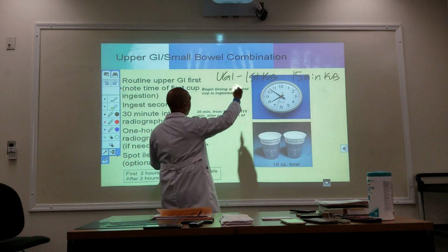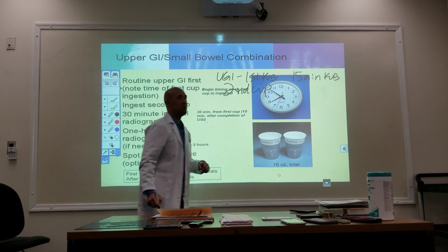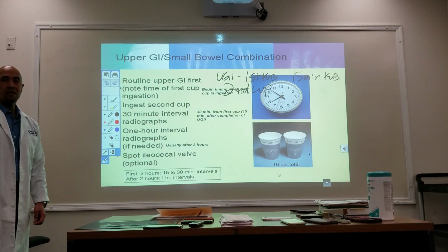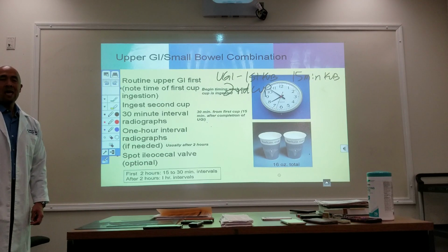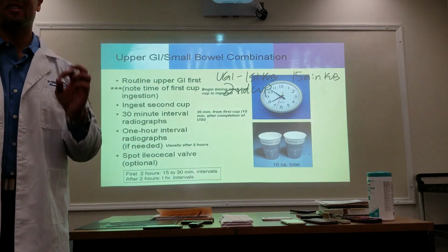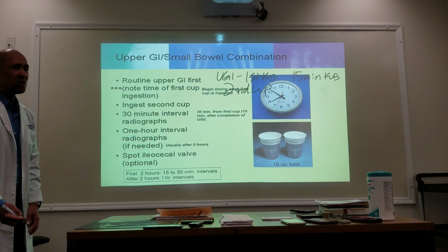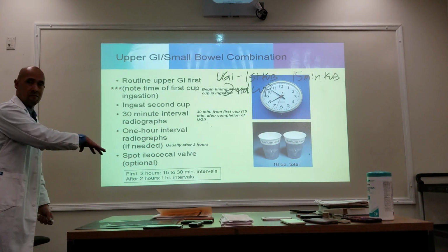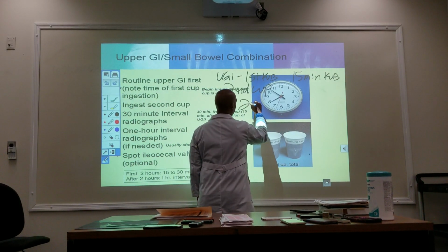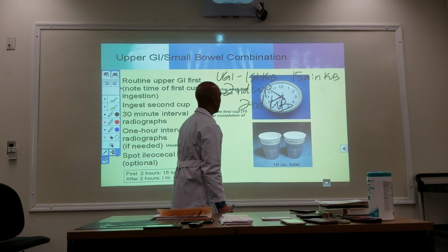And then what they're going to do here now is they're going to drink their second cup. Drinking their second cup. Okay? And by the time they're done drinking their second cup, because trust me, you can't guzzle barium. So it's going to take them a while to drink that barium. So by the time they're done drinking the barium, you're going to lay them back on their belly again. And now you're going to take your second KUB. Okay, this is 15 minutes later.